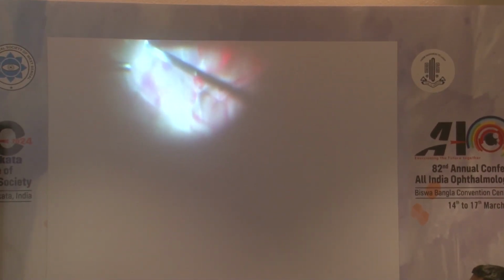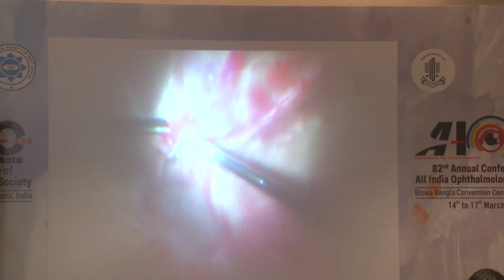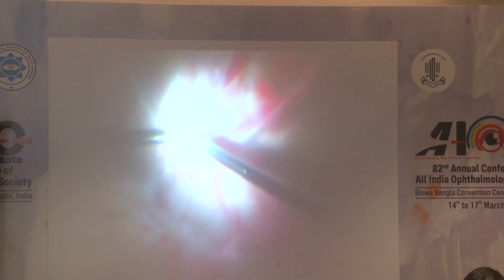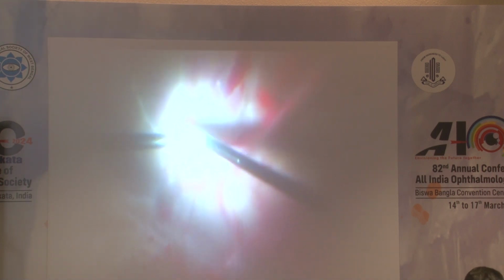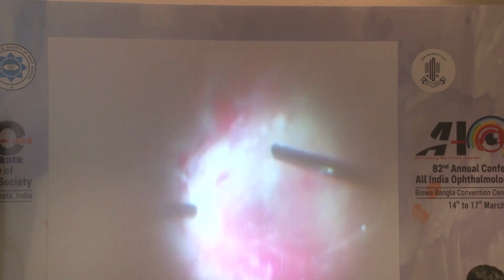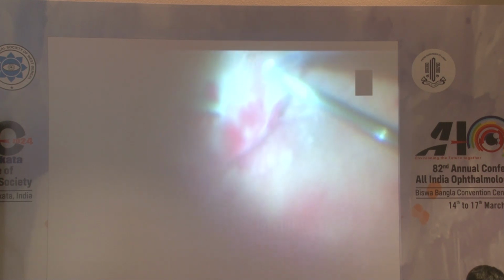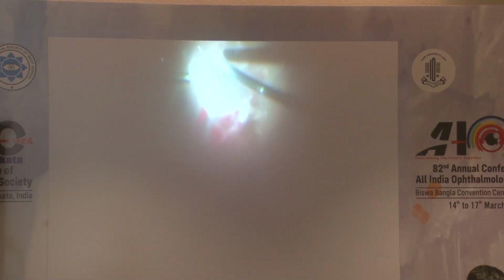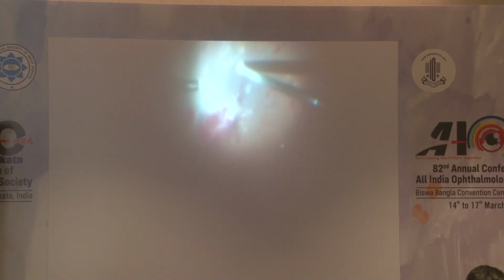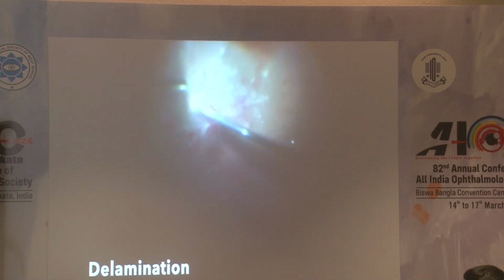Going on to the next areas, now we are peeling the vitreous off the surface to reach towards the periphery. Now this has to be done very slowly so as to avoid undue traction to areas which may create breaks. So now again debulking over the surface so as to see posteriorly what is being cut or pulled. We go in again through the same area and we try to delaminate this area. Now what we are doing is outside in, we are just peeling off this area.